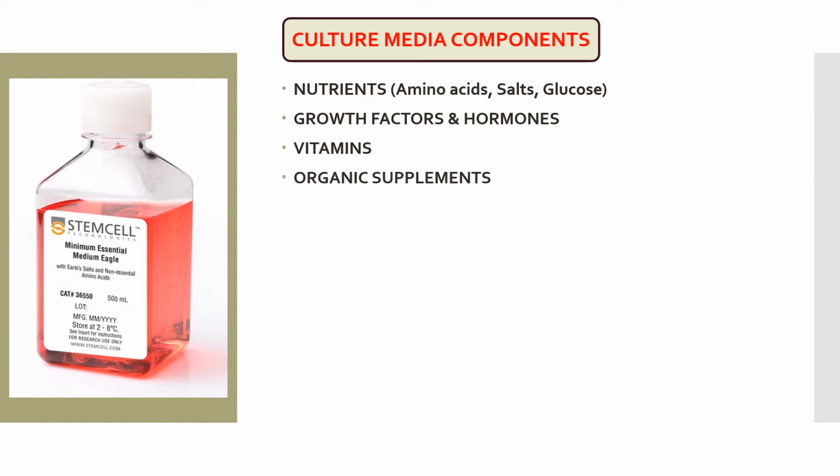Also, various compounds including proteins, peptides, nucleosides, citric acid cycle intermediates, pyruvate, and lipids are found in complex medium as organic supplements. These substances help in maintaining certain specialized cell lines. Antibiotics are also added to the growth medium to reduce the frequency of contamination in the culture.